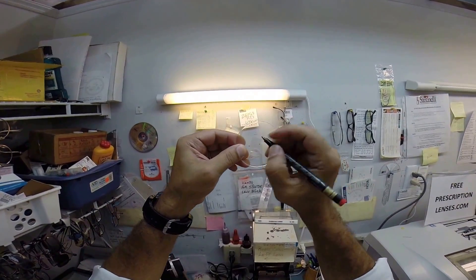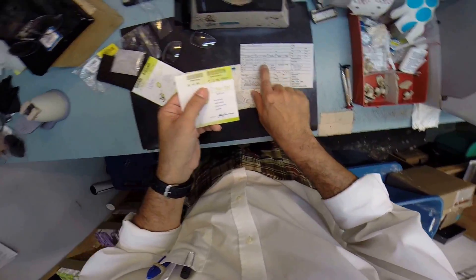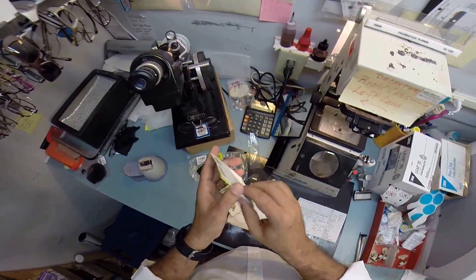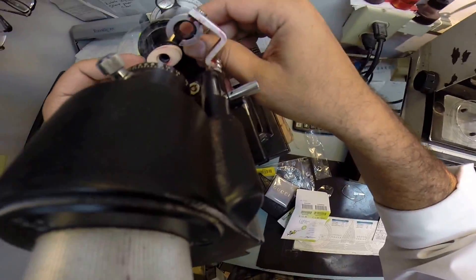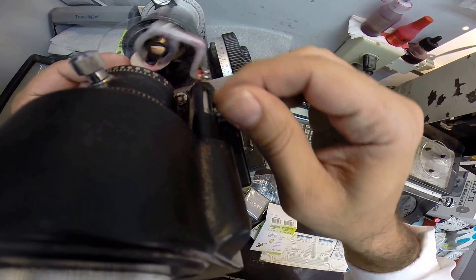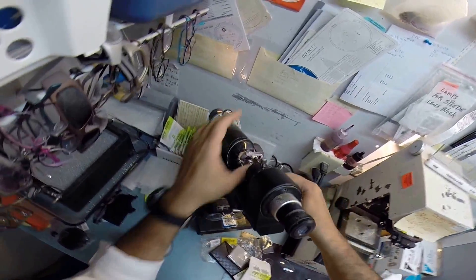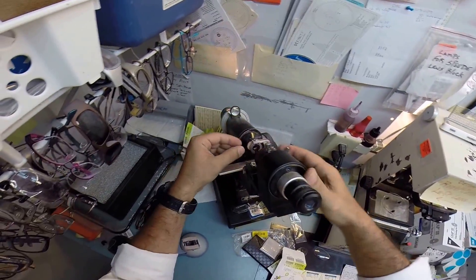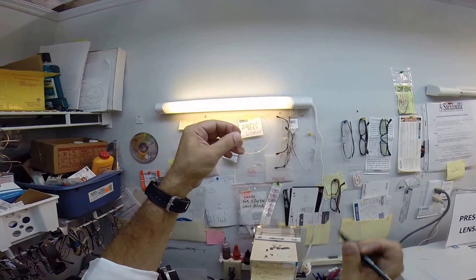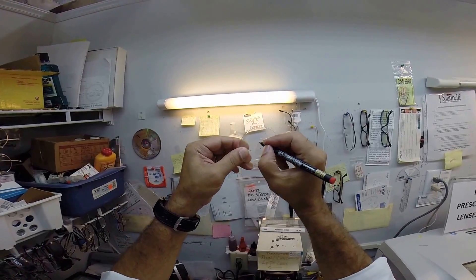That is the right lens. I'm going to do the same thing now for the left, which reads plus one minus one at 179. Move the axis wheel ever so slightly, put the power drum on plus one, rotate your lens until the sphere power comes in clearly. Put a couple dots on there — make sure they're dark enough so everyone can see at home. Let me grab my pen and darken all those. And that is the left lens.